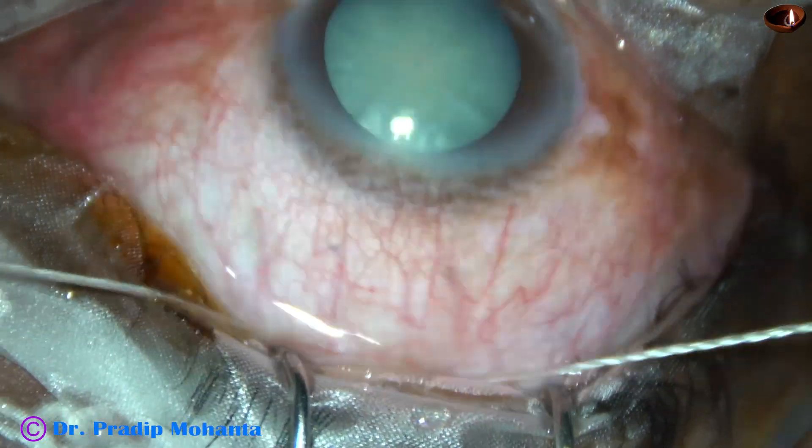As I pull this suture, there is a lot of space in the upper part of the sclera where we are going to make a sclerocorneal tunnel.